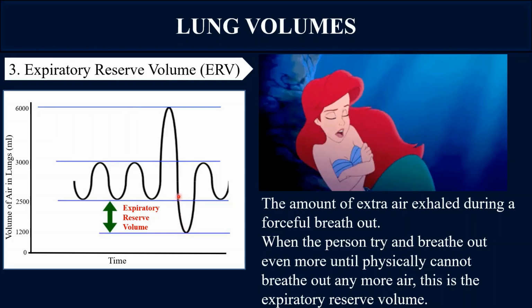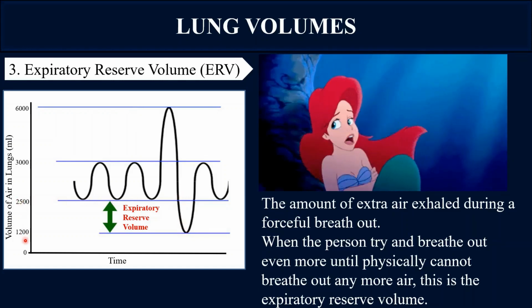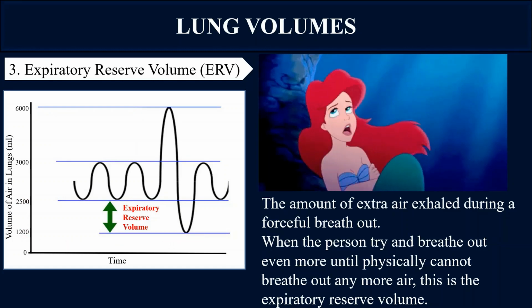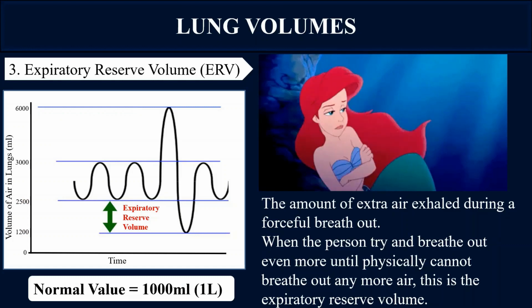If we look at the measurements, this is 2500 and 1200, and we measure the expiratory reserve volume. The measurement of the expiratory reserve volume is 1000 milliliters.